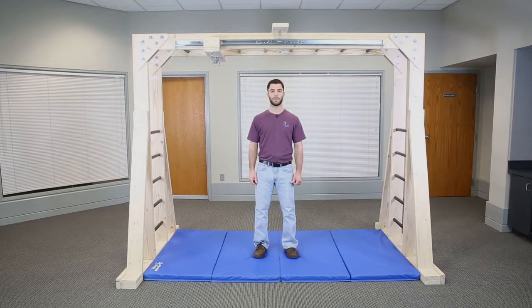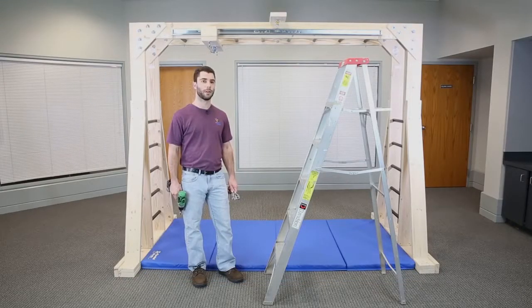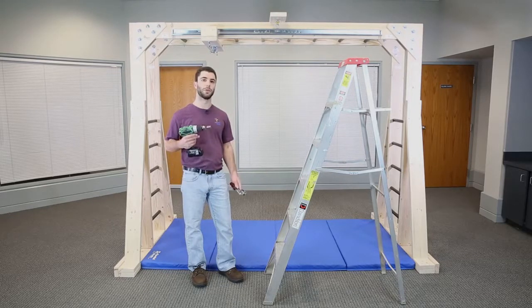The gym you see here is our 8-foot model. I also like to mention that the mat that I'm standing on is not included. First, we'll discuss some of the tools you'll need. You will need a ladder, a small selection of hand tools, and if you choose, a power drill. Let me show you more specifically the tools you'll be needing for this assembly.